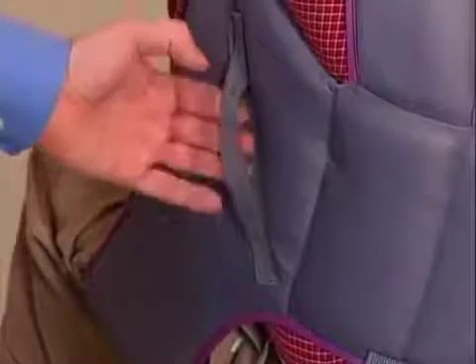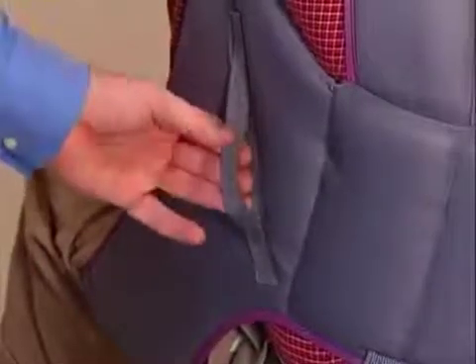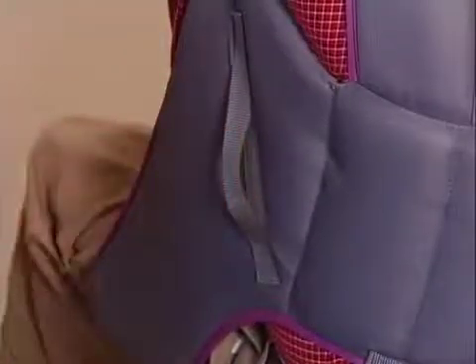Most slings have reinforced grab straps sewn into the back to assist you in guiding your resident. And although Invacare lifts and slings have been designed so they can be safely operated by one caregiver, it's recommended that 2 caregivers perform all resident transfers.